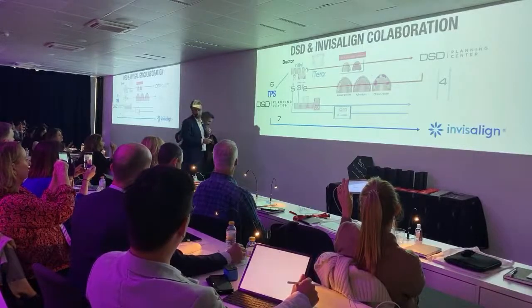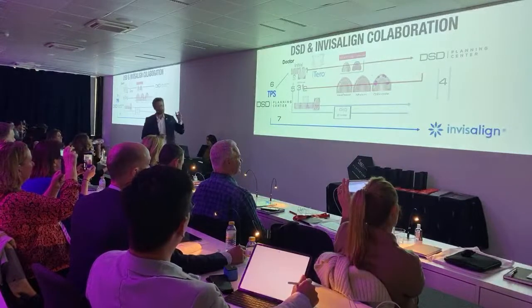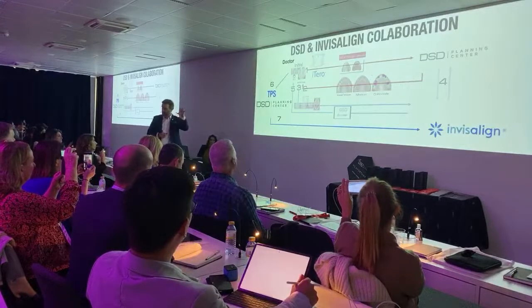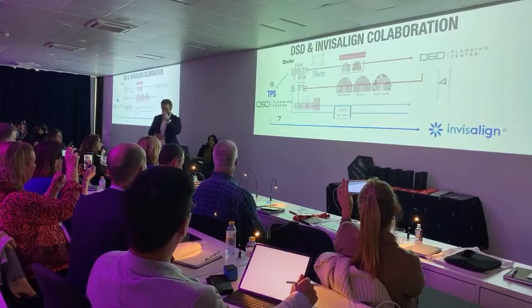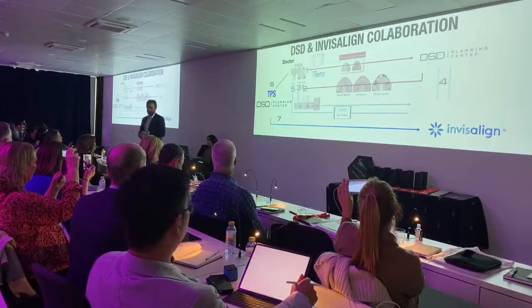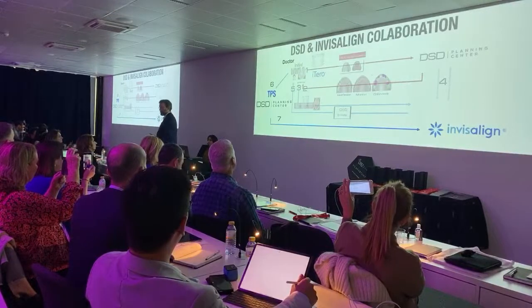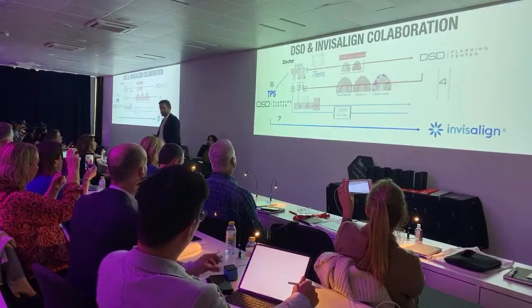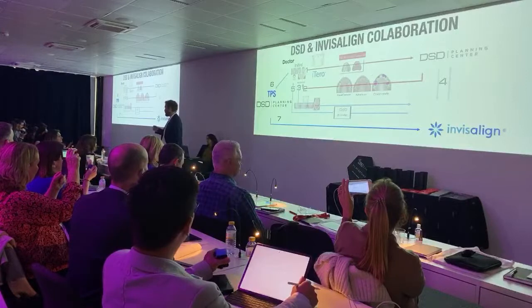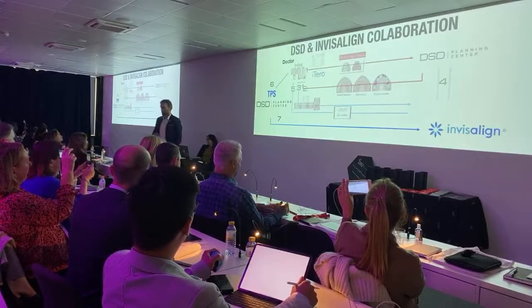This will go back to Costa Rica and then go back to you. You will open the case, check, change whatever you want, of course, like always. You can send the case back again to us if you want, or you just make your fine-tuning and send to Costa Rica again. Or if you don't need to make any modification, just approve and send to manufacture the aligners.